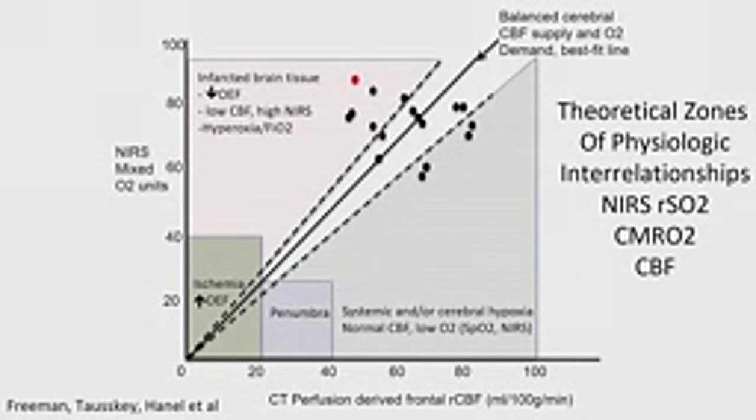And the black dots represent the human cases of NIRS. And this was a very tedious experiment. What we did is we measured NIRS units right before we stuck them in the CT angioperfusion scanner, and then we delicately applied the NIRS numbers on the back end. They don't really make plastic NIRS catheters yet.